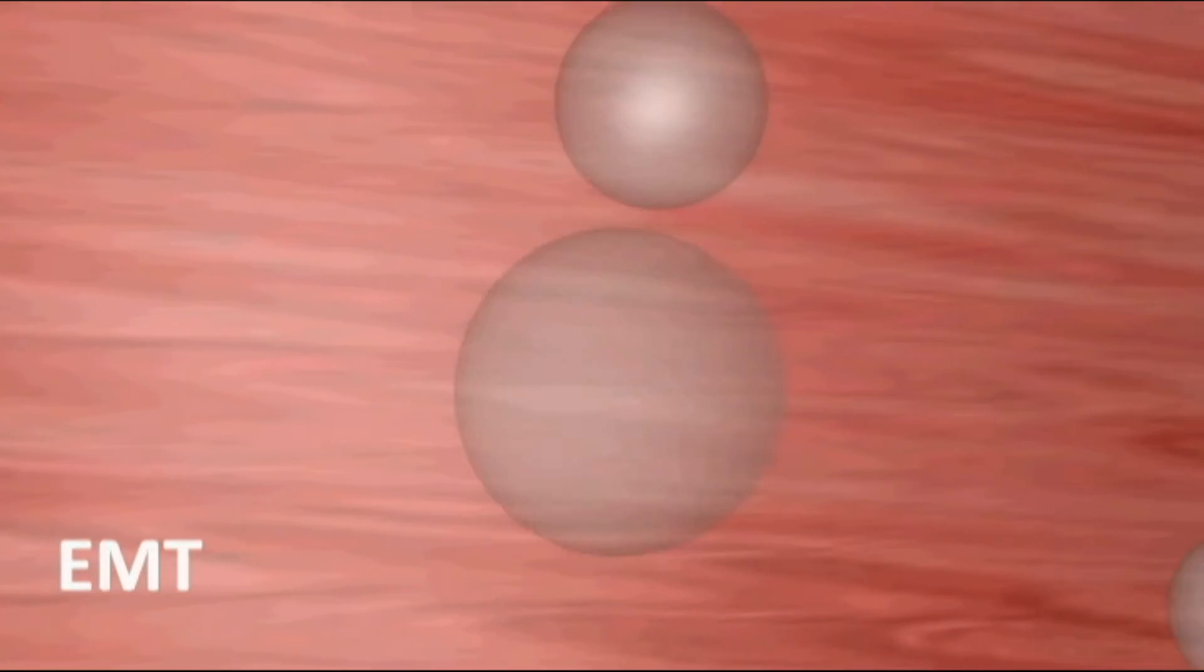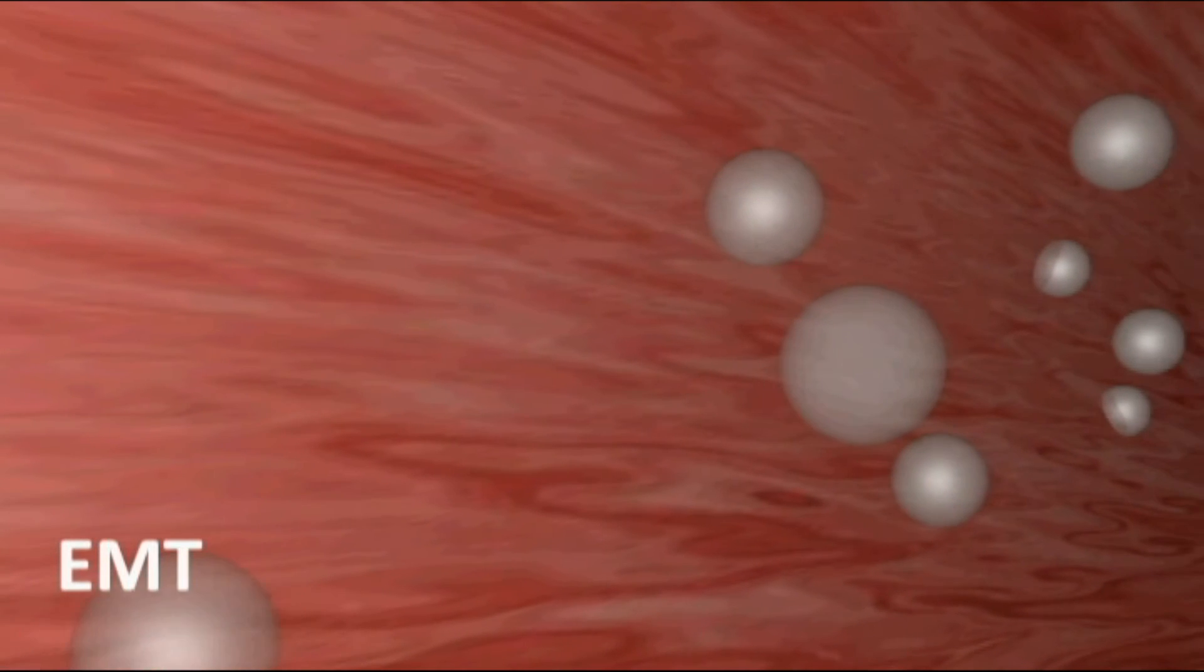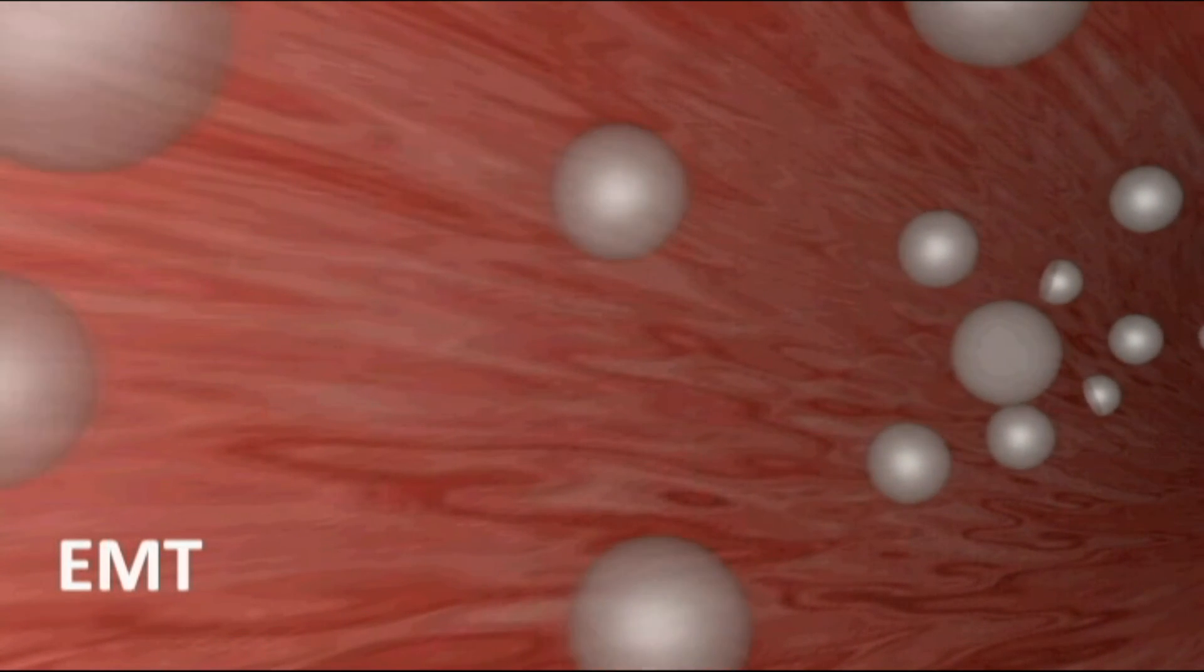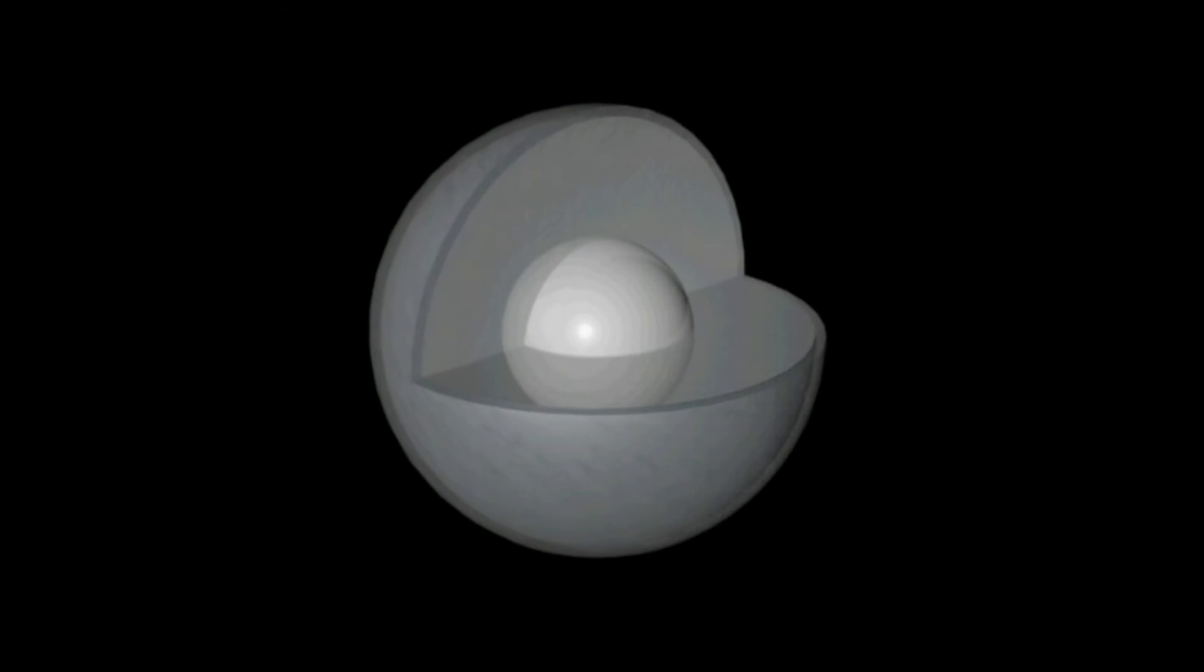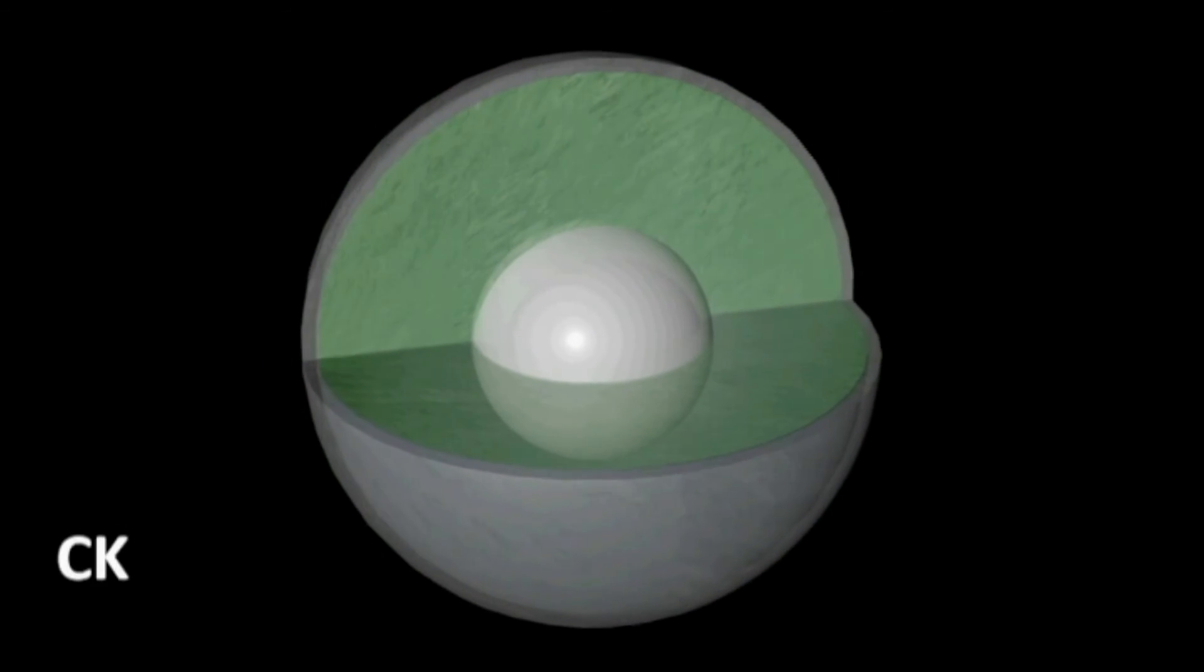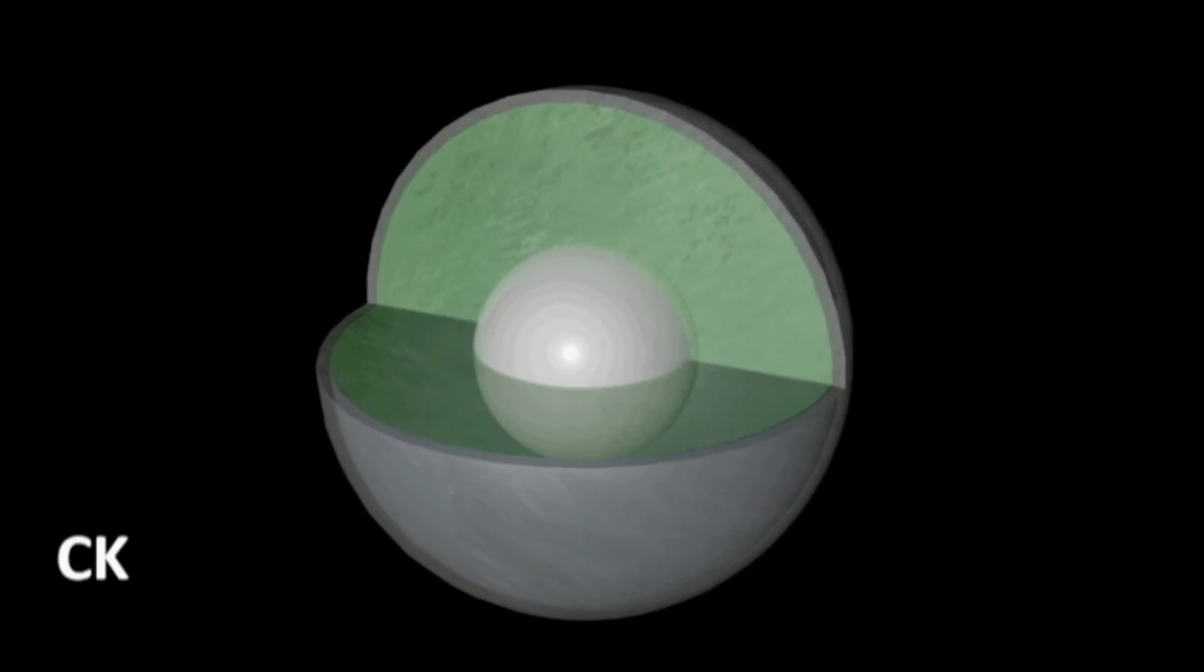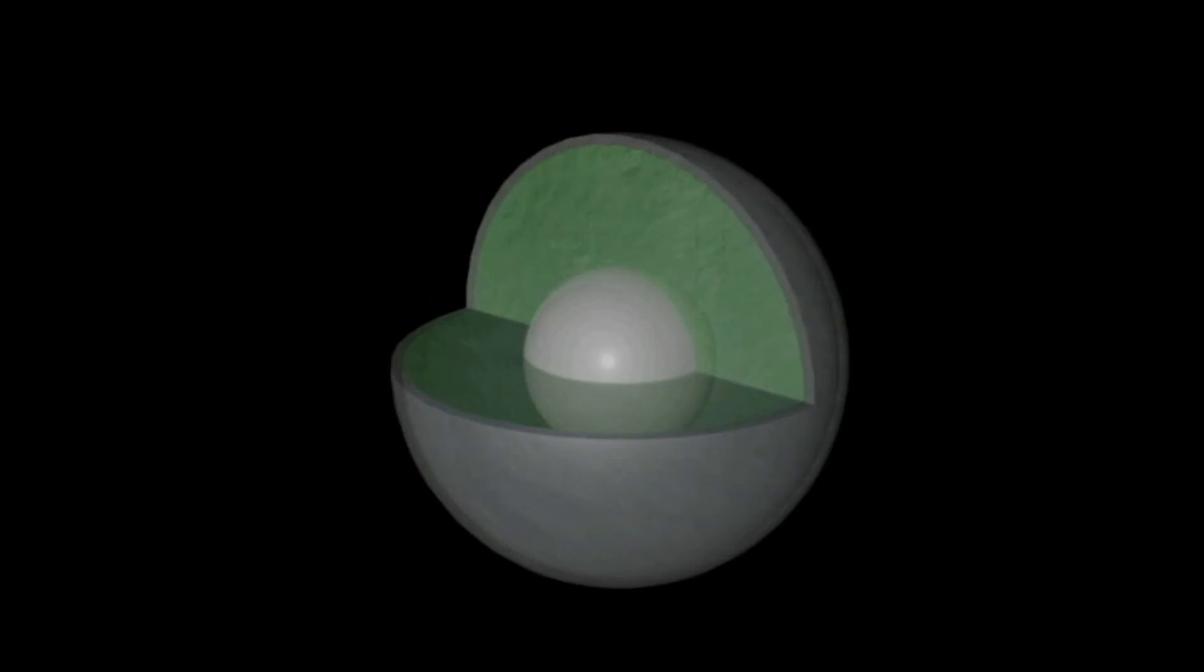The hypothesis is that the cancer cells that generate metastasis are cells undergoing EMT. Therefore, EPCAM is not an ideal labeling target. By Cytotrack, the CTCs are identified directly by the CK labeling. The EPCAM preselection step is eliminated. The extreme high scanning capacity of the Cytotrack scanner makes it possible to identify the CTCs by the CK labeling alone.